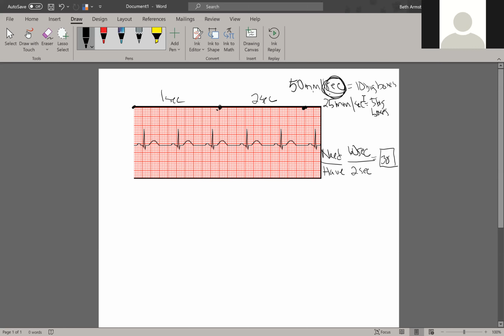Okay. Yes. And then why do we count the first row when it's not a full row? We counted the first 10 boxes here, and then we counted the next 10 boxes here, but not these last 2 boxes. Does that make sense?